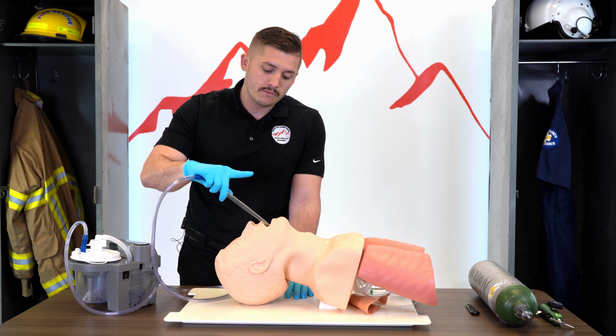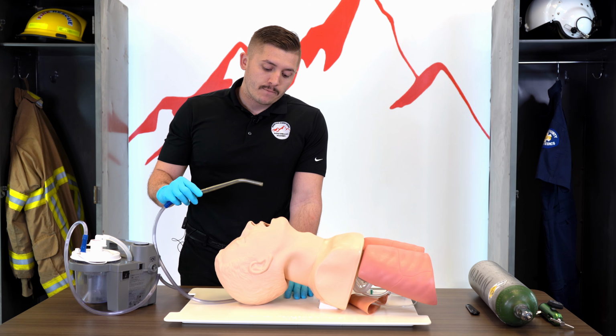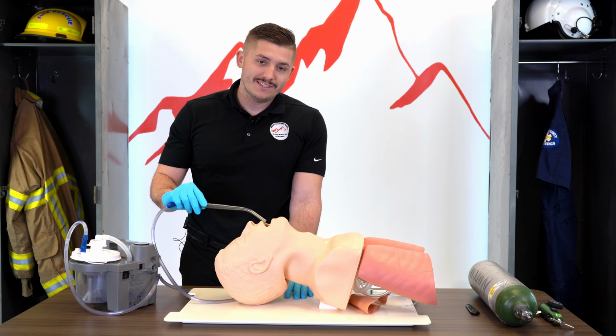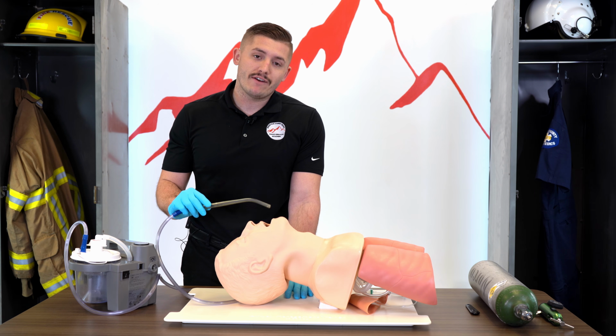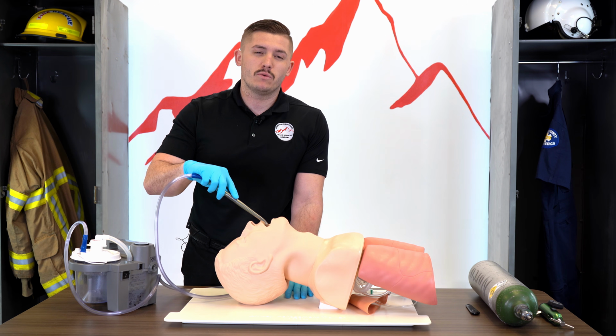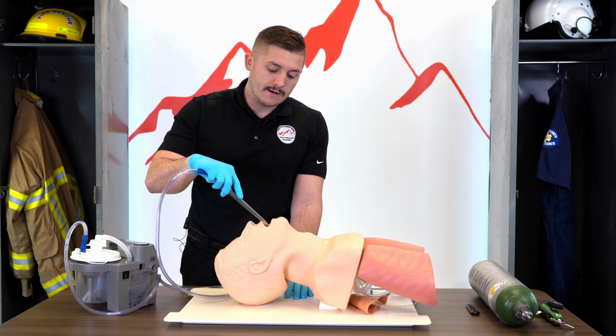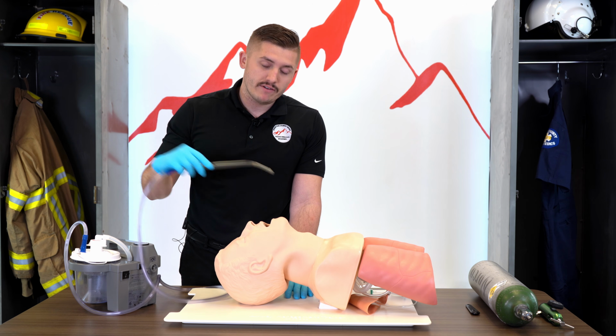Cool, our tip is still clean. I'm going to go back in without suction and continue to suction. We try not to do this more than 15 seconds. We don't want to deprive them of oxygen, but I'm not going to try to force a breath with a bunch of fluid. So just really do your best. Try to clear the airway. Yeah, and then start giving a breath once the airway is clear.